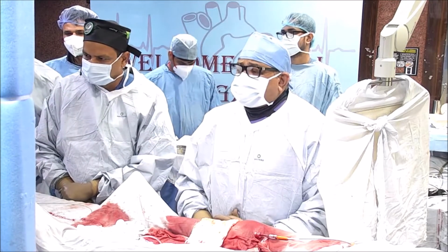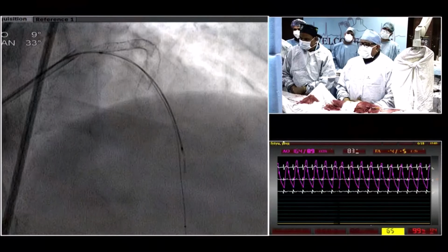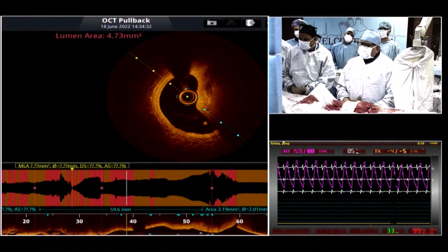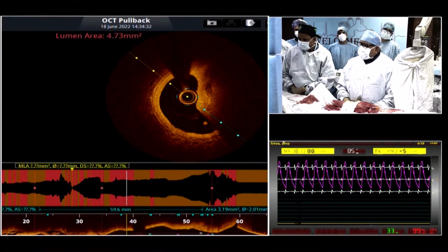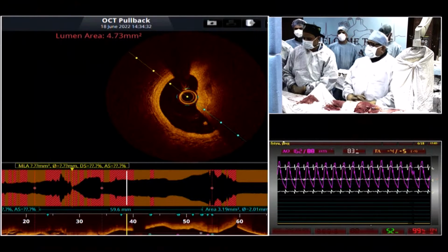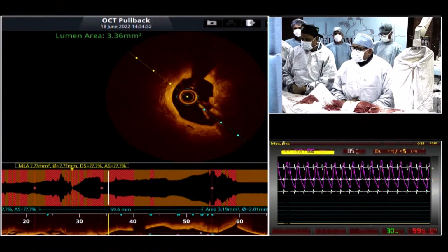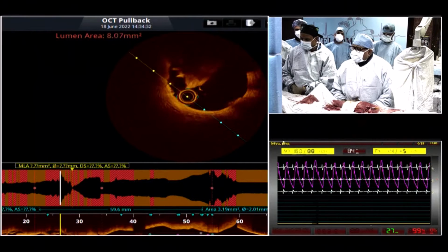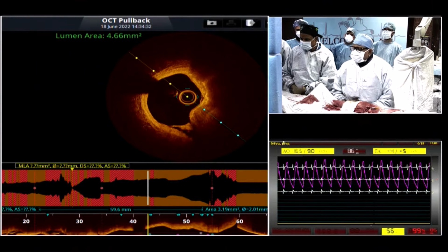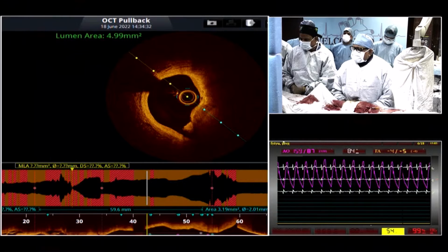There's a calcified nodule. I think so. Okay. So you think that you possibly can go again with a... We have already rotablated. But do you think after rotablation the nodule is still there? There's a calcific nodule for which IVL is an option, off-label use. If you don't modify it, you're going to have an unexpanded stent at that portion. You may have an unevenly expanded stent. We can have IVL after that, off-label use.